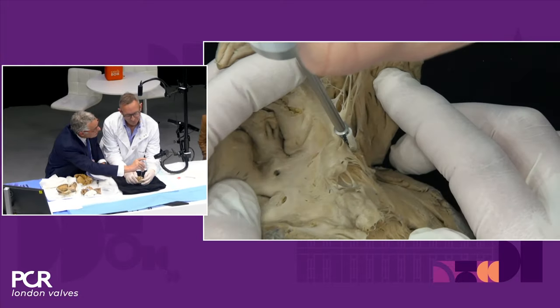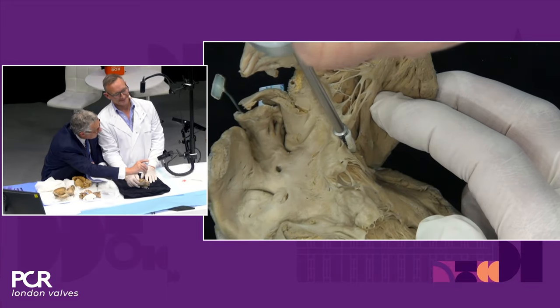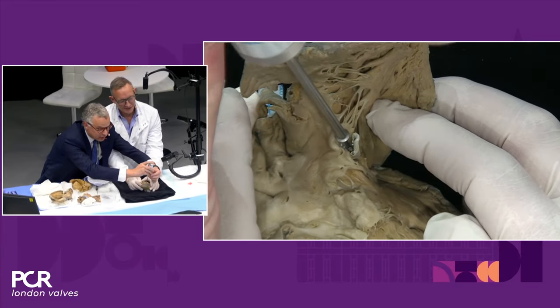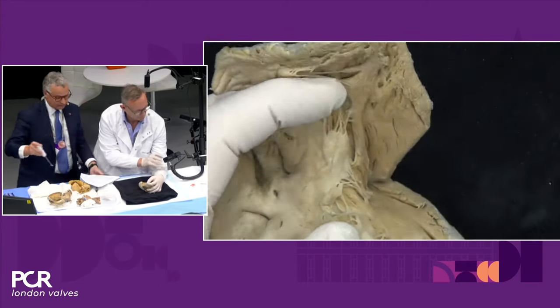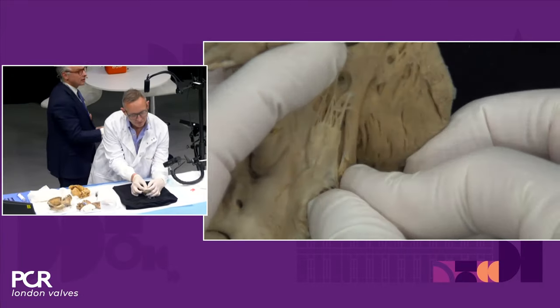Now, Marty, can you do echo here? It's not good, eh? Yeah, it's not good. Thank you. So then I have to reopen the clip, lift the grippers, and reposition. Yep. And you see there is no big sign, maybe.